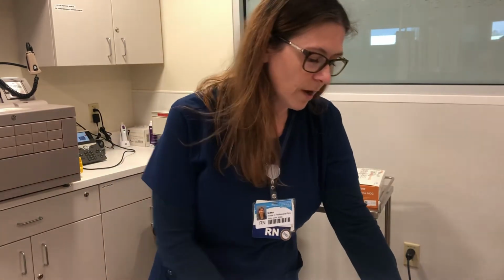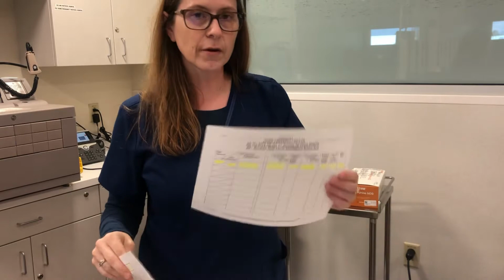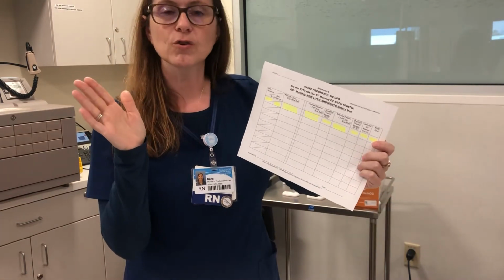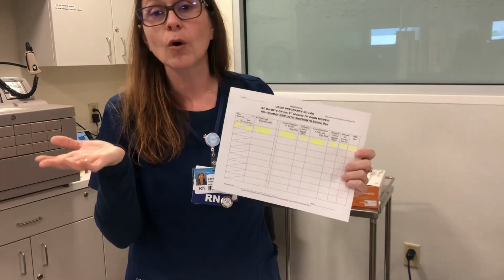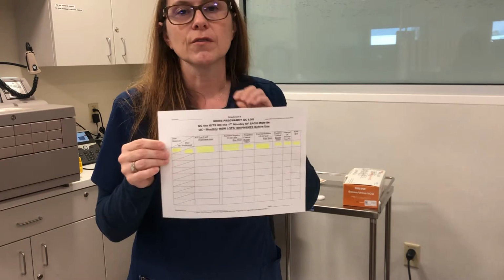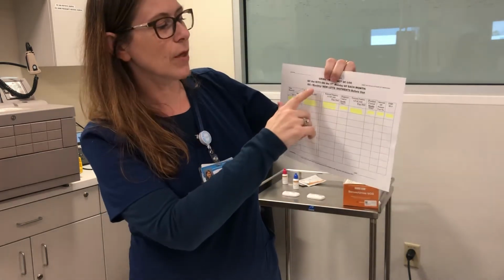I said I would show you how to document. So we have two different documents in there, both in the pregnancy binder. The very first document that you're going to record on is the QC kits on the first Monday of each month. Now today is not Monday, but as long as it's done within that first week, especially knowing that we're not open here on Mondays, right? Right now we're not open at UPW on Monday. So as long as it's done during the first week of that month.